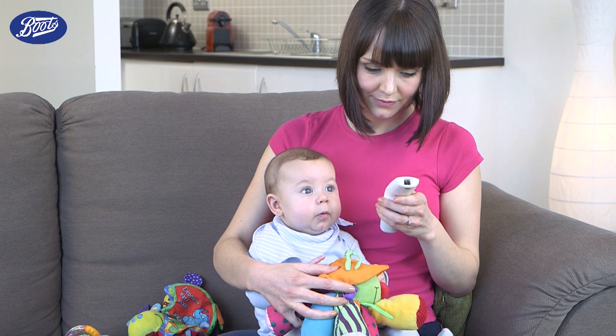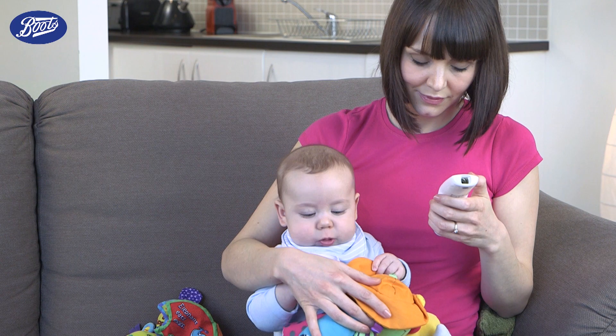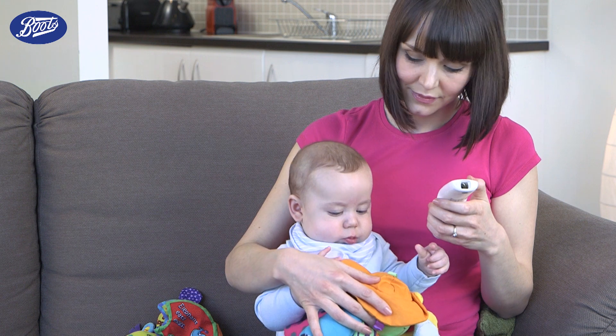The screen will show a happy or unhappy face to indicate whether the temperature reading is normal or raised, and the temperature is displayed within 2-30 seconds.